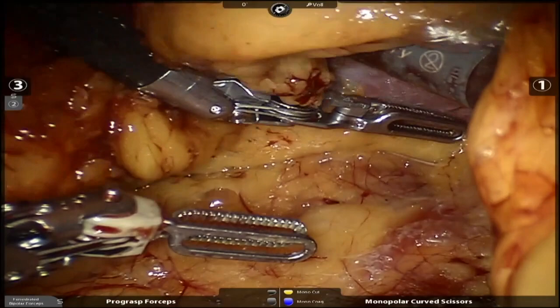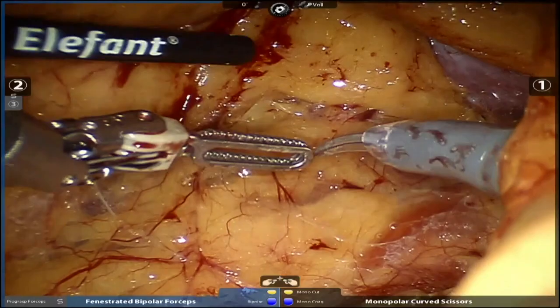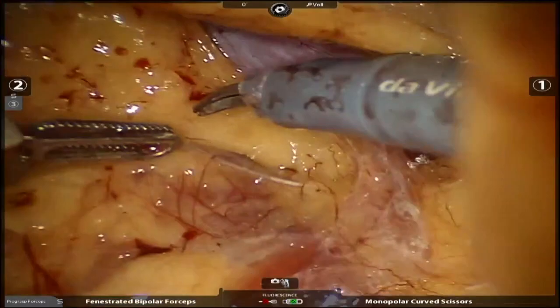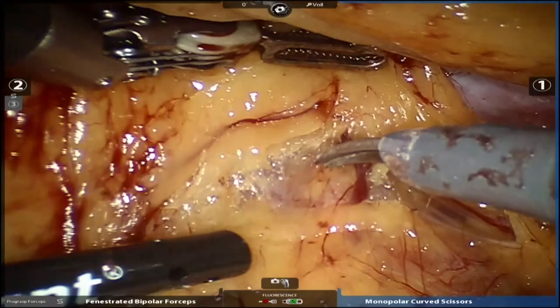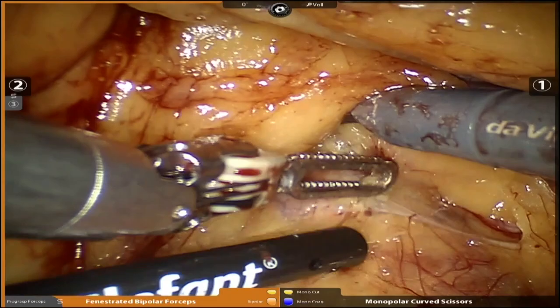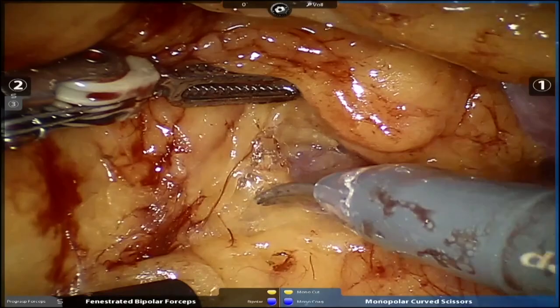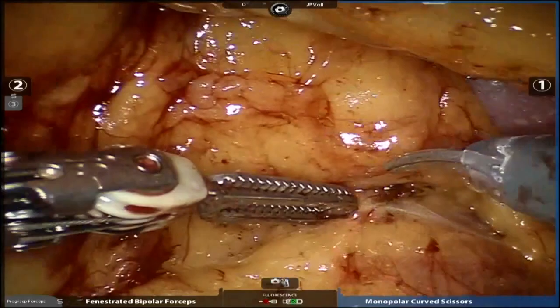And do you feel a difference for retraction, depending on the type of robot you use, or is it more or less the same? Because one important part is to have good retraction, just like here, that you retract the kidney to really see the artery. So do you have always the same quality of retraction with all the robots? Well, I think the retraction is clearly better with four arms. Now, I used to do all the retros with just three arms, one-handed surgery, which is what we did laparoscopically, which is no problem. But it's clearly better, Brandon, come off, please. It's clearly better if you have a retraction arm, because now I have two arms to dissect out the hilum. And that's much better than having just one hand.